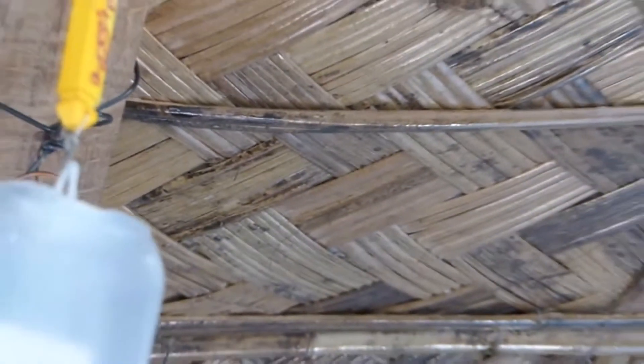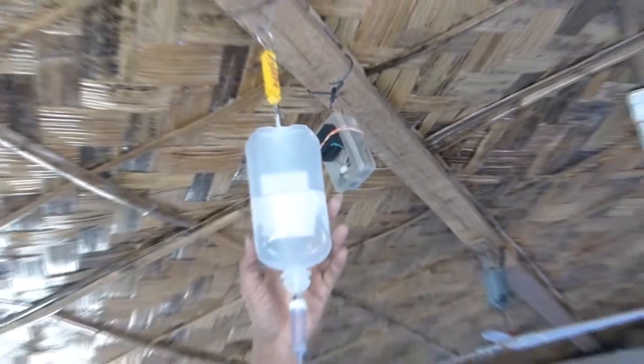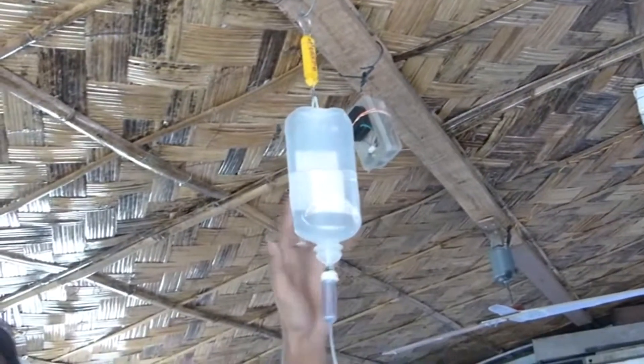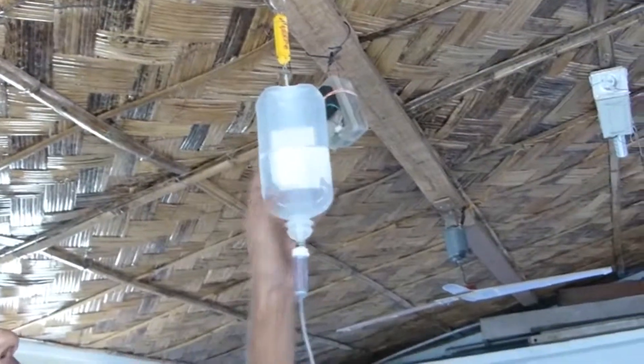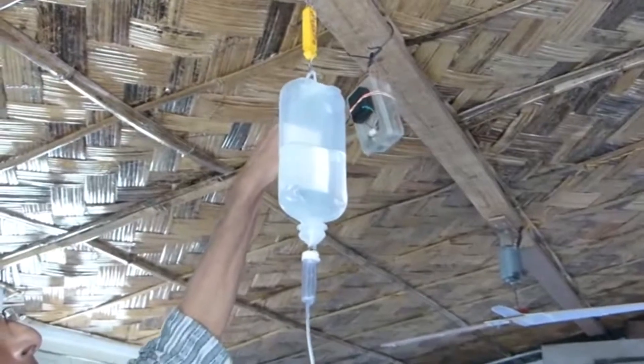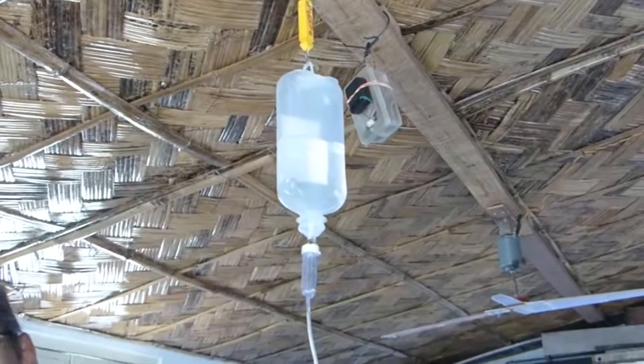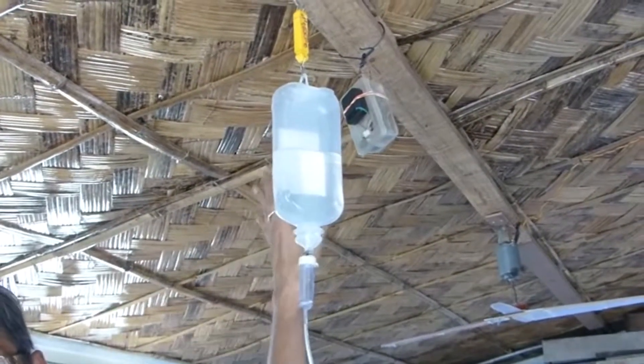Now we hang this bottle here on the switch. This is half filled. We have calibrated roughly in around 100 to 110 milliliters of saline will be there and the alarm will start functioning.